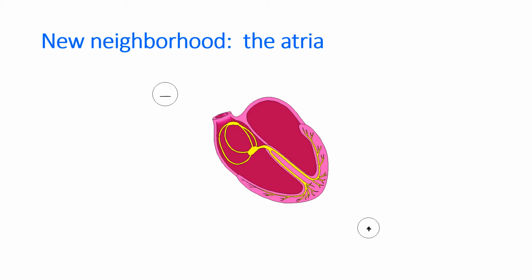The normal depolarization starts from the top of the atrium and works its way down, from negative to positive, so these are all going to be positive deflections. Then it goes down into the ventricles, throughout the ventricles. That's how your conduction is. And if it was a deflection away, from the positive to the negative, it would look upside down.